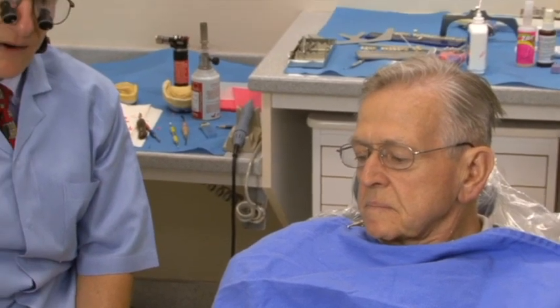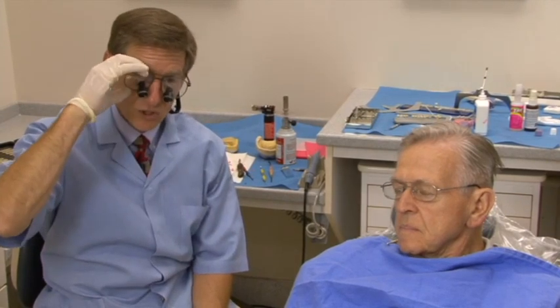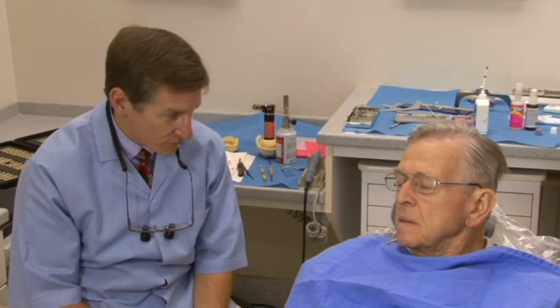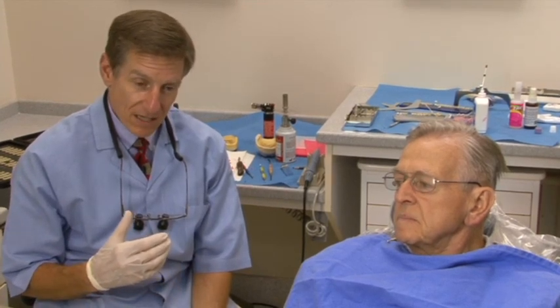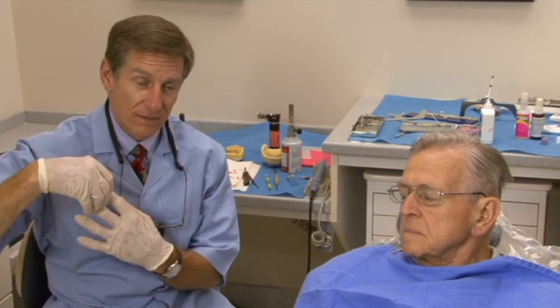I don't take a whole lot of time at the wax try-in unless I've got to move things. If I've got to move something, I'm going to move it right now. If they were too long, we'd give him a hand mirror. The biggest problem you're going to have with this technique is getting the teeth too far out — patients will tell you they have bulky teeth, sticking out too far, showing too much. Be careful moving them too far back, because the neutral zone is compressive and a patient can't adapt back to where they were before they lost all that support.